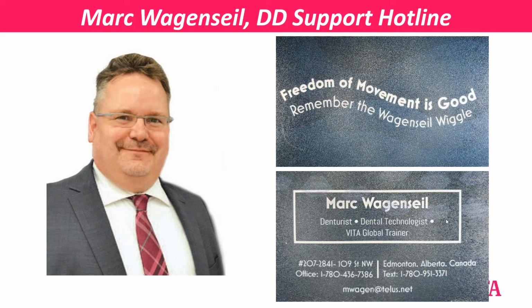Great question. What's worked for me in Mark's world is I do it in the lab. So everything gets done in the lab, and then I insert it without the nylon O-rings in, and I just make sure that it fits passive. And I check everything, and then I put the O-rings in chair side, and then snap it in. That's been effective for me, and that's how I like to do it.